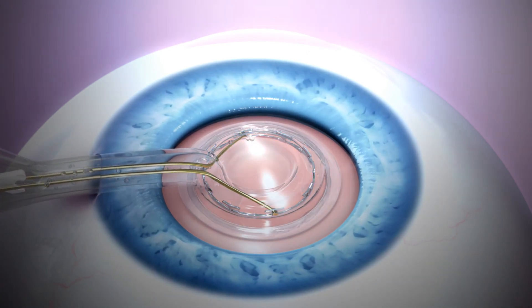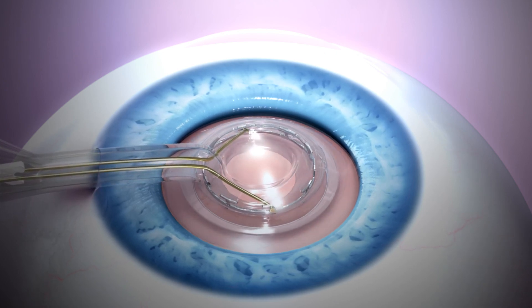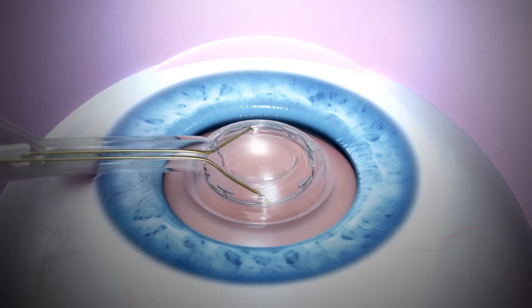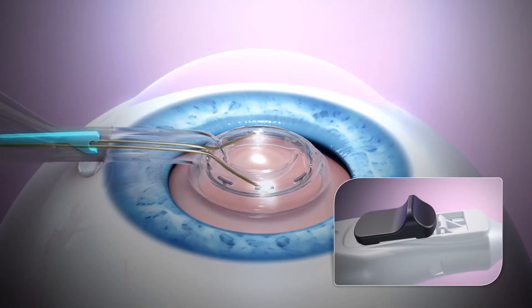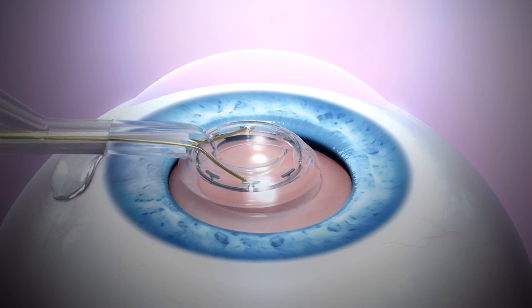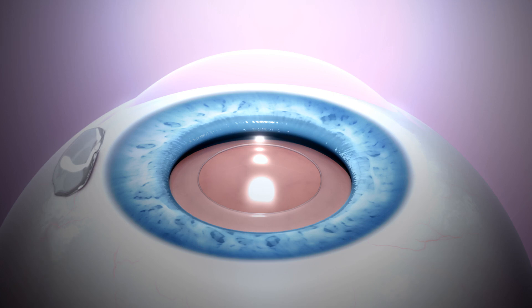Suction is then reversed and viscoelastic pushed back into the suction cup with a small amount of balanced salt solution, floating the Zepto tip off the capsule. Additionally, the pushrod may be placed back into the neck to assist in floating the tip off the capsule. The soft tip collapses as it exits the incision.